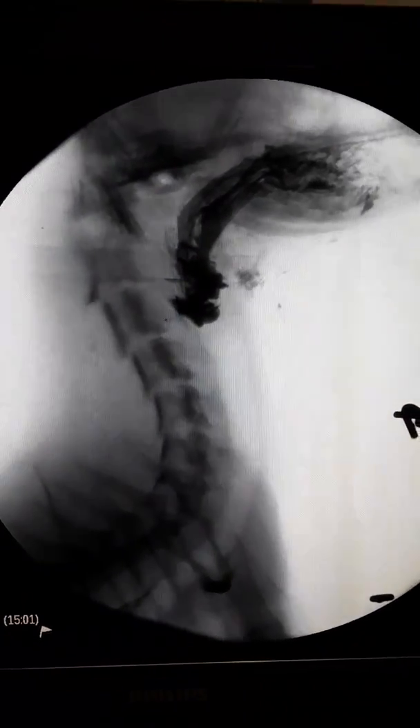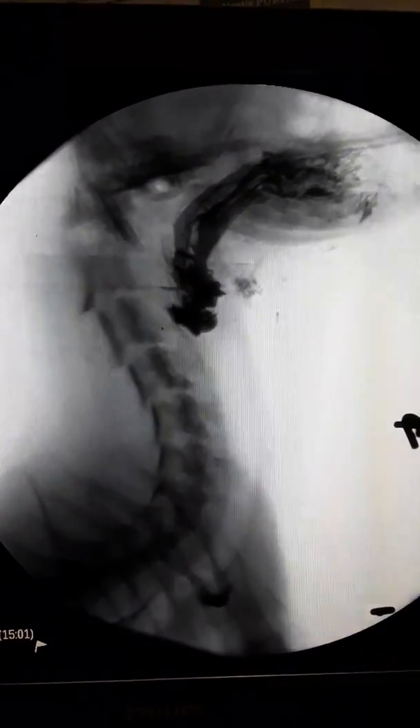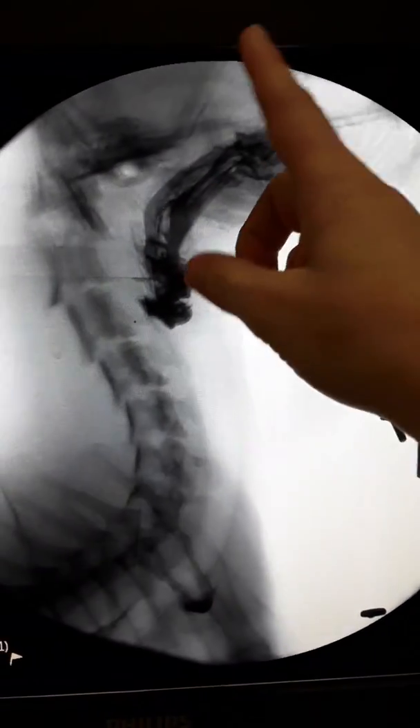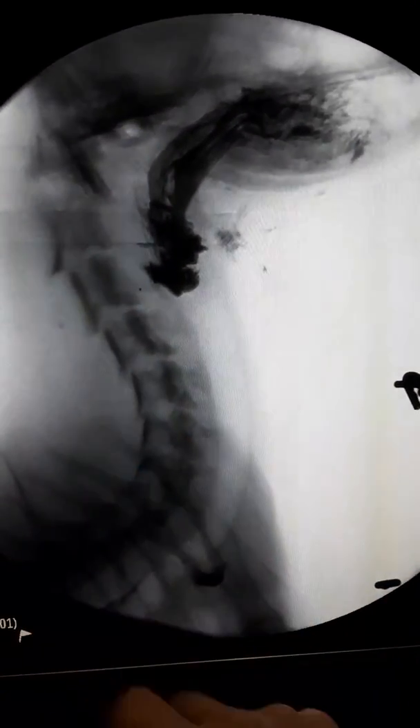We're looking at an image of Bumper. Right now we have Bumper frozen here. We're looking at her head facing forward. She's in profile, so here's her neck going down into her chest.